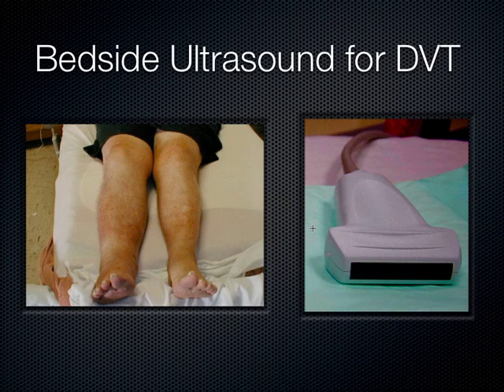What we use is the linear transducer. Some people call this a vascular probe, but we can use it for so many more things than just blood vessels. And what's the biggest blood vessel in the body? The aorta. It's a deeper structure. You wouldn't want to use this probe on the aorta because you've got to get the sound to penetrate all the way down to the spine, basically, to see the aorta. So that's why I don't really like calling this the vascular probe, because it's got so many uses and you wouldn't want to use it on the biggest blood vessel. So I always call it the linear probe. But just so you know, you might hear someone call this the vascular probe. And it's the one with the highest frequency.